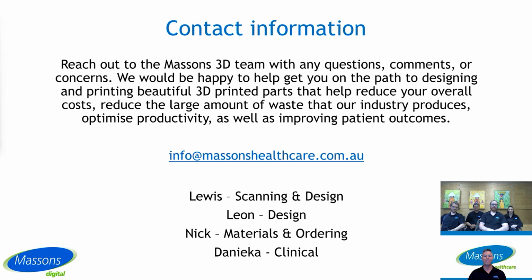Thank you. The other difference is you could scan a foam impression box if you wanted a semi-weight bearing scan. Or you can scan a cast. I would say as well, we have had fair success in merging scans. So if you took a scan with a cast, just so that we know where everything is in relation, especially if you do fiberglass and there's a consistent thickness, it can be fairly simple to reduce the thickness of that cast out, take a crush box scan and actually replace the foot with that, so that you know everything's in the right position. There's multiple ways of stitching together if you can't get it in one either.